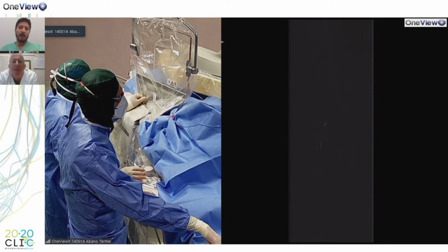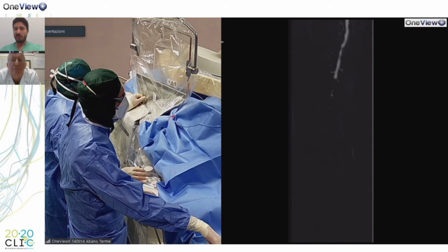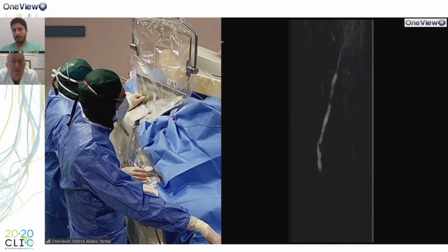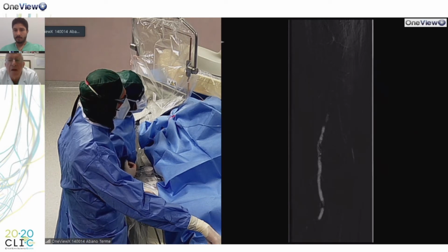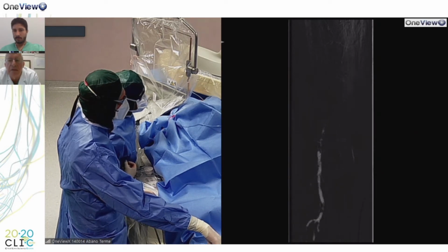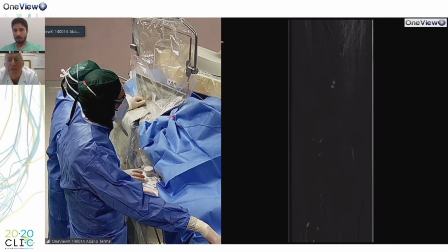And in your experience, how frequently are you able, injecting from the sheath 20 mLs of gas, to study also the foot without super selective injection? Yes, of course. Okay, that's the plaque. It's an eccentric plaque. And then we have a trifurcation below the knee.